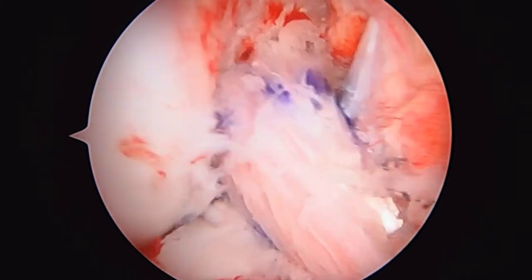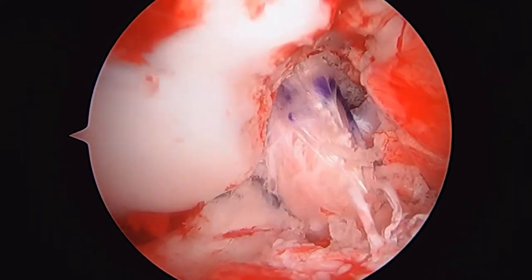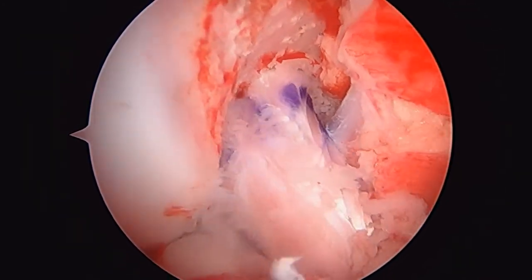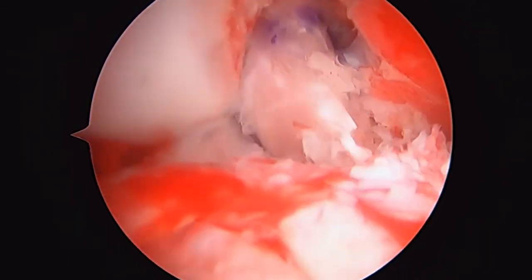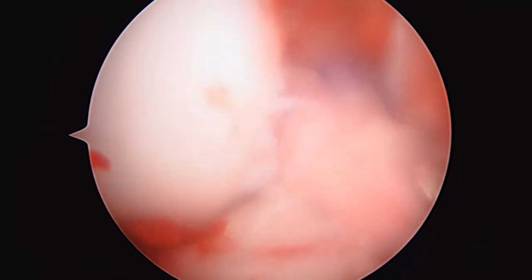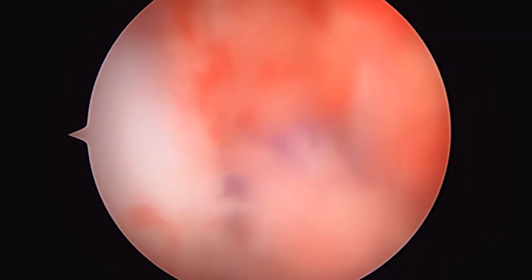Here's the new graft in position — it looks good. You can see it running up in the middle of the knee. It's fixed on the femoral side; we haven't fixed it on the tibial side yet, so we've still got a little bit of work to do. I just wanted to show you what it looks like as we take the knee into full extension and then flex it up. It looks like it's in a good spot.